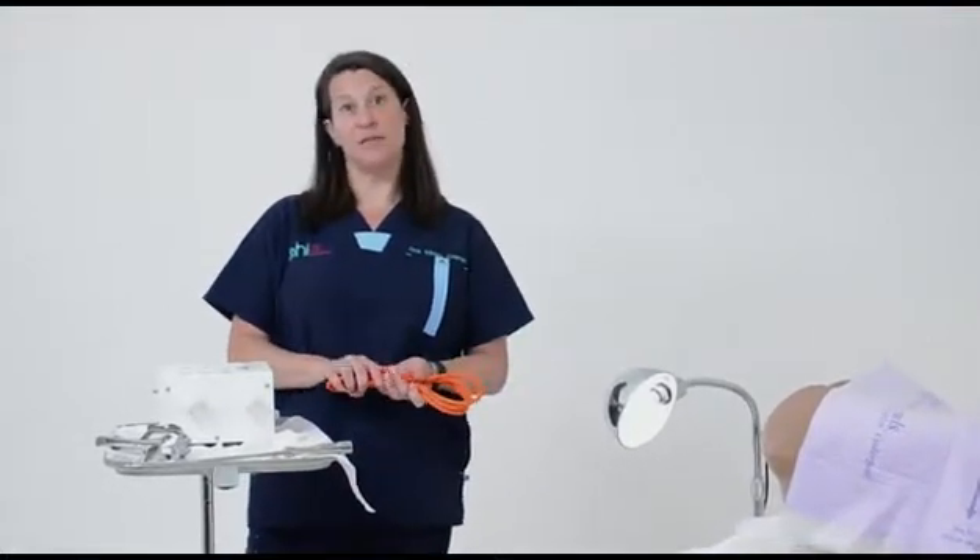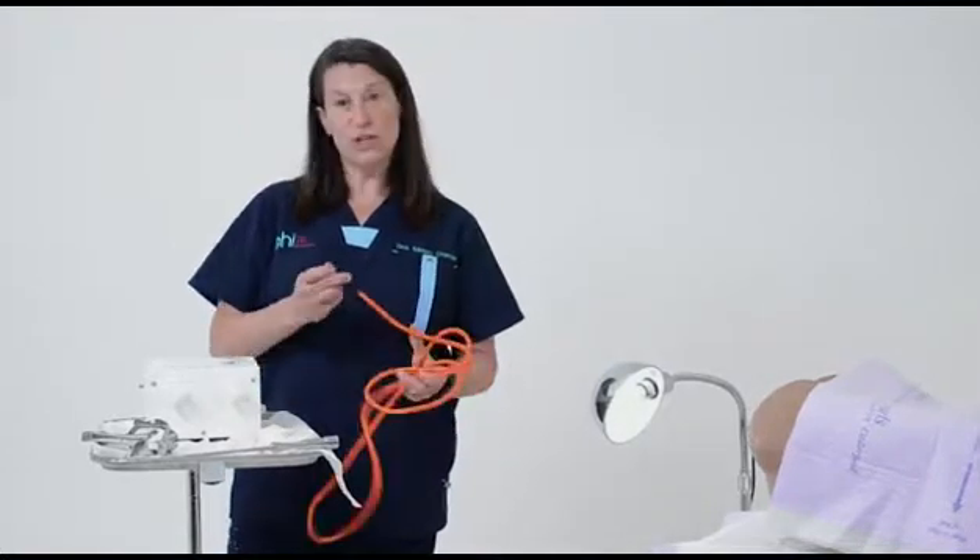Thermocoagulation is used for the treatment of cervical pre-cancer, and as you know, cervical cancer is one of the leading causes of cancer death in women in low-resource settings. So this machine is a great method for delivering treatment to women who need it.